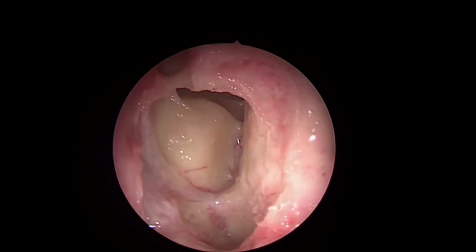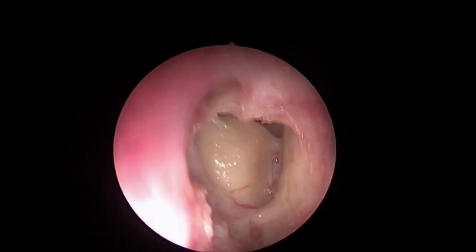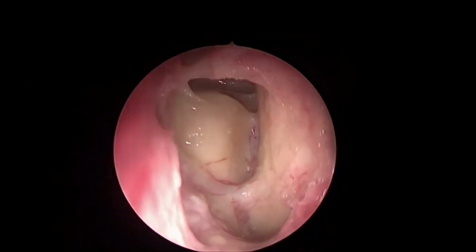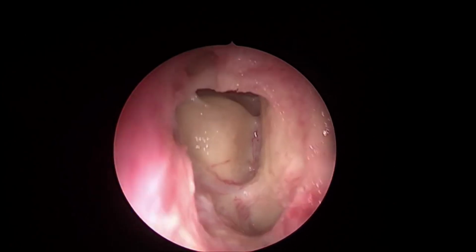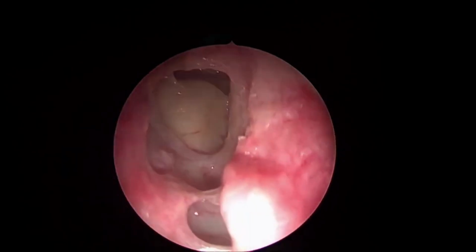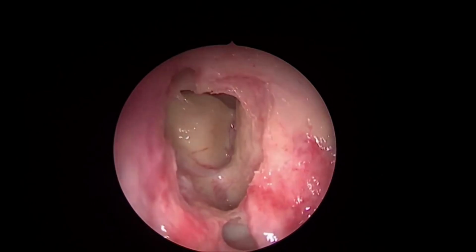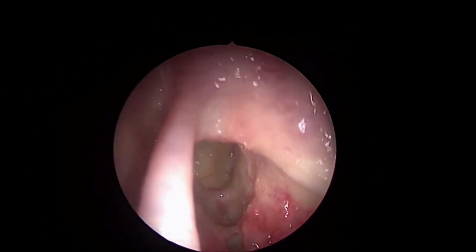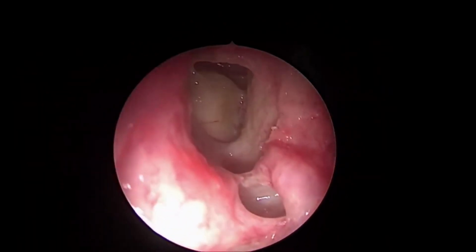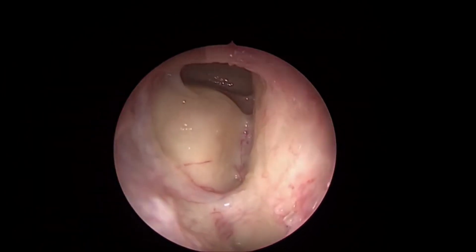As long as you know where your enemies are. So in this case, your enemies are the orbit, the skull base or the brain, and the anterior ethmoidal artery. As long as you know where they are, you can remove everything in between them, as long as you preserve the mucosa. Very nicely done. That's important. So that is a take-home message from the master. Preserve mucosa. See, in the recent classification from the American Society of Rhinology, the most difficult of the frontal sinuses are those wherein the previous surgery has given fibrosis and neo-osteogenesis.